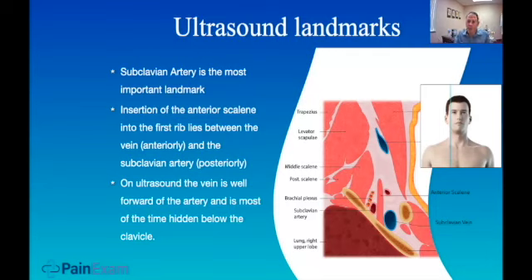So when you're doing these blocks, I'm sure most of you are already aware of, you need to capture an image of the needle next to the nerve on the ultrasound. Easier said than done, because when you're doing a block, you're not really thinking about saving the proper image. You're thinking about taking care of the patient. So sometimes you may or may not get that image with the needle next to the nerve, but at least have something that you could show the billing company or the insurance companies in case you're audited.